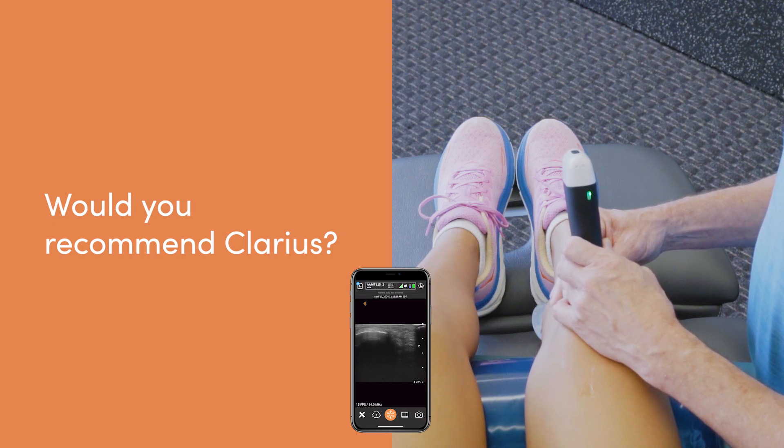The way you can see superficial tissues especially is comparable to a lot of very expensive systems. I'd absolutely recommend Clarius to new students trying to learn how to scan — it's got a good price, good image, and with all the new features it's easy to use on your phone in a busy clinic or a small cash practice. Once they start getting used to it, it's going to be hard to not use it on a regular basis.